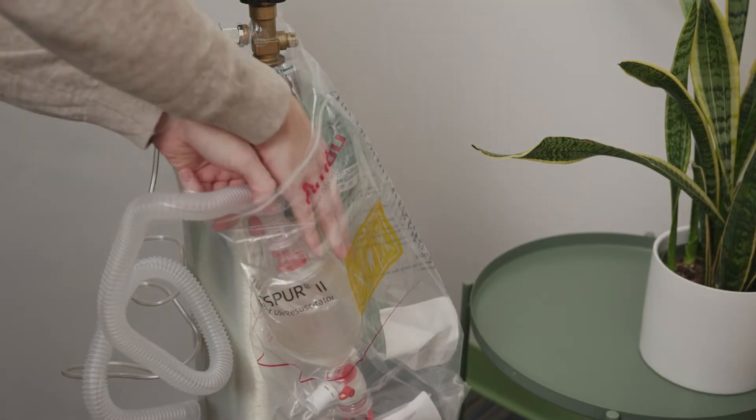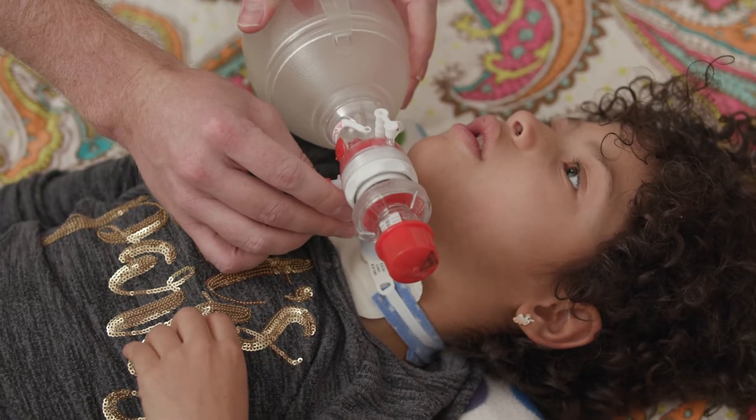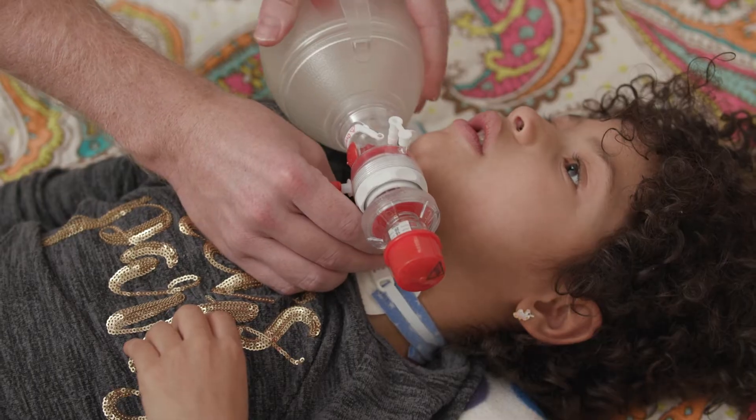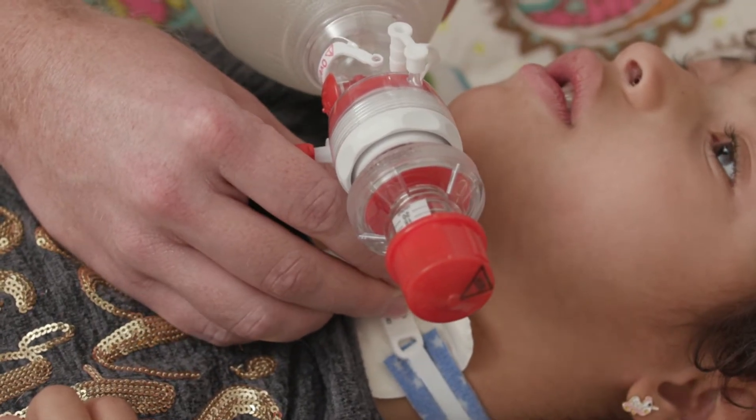If your child is on a ventilator, you will need to disconnect the ventilator and attach the resuscitation bag directly to the trach. If your child is not on a ventilator, you may skip this step and attach the bag directly to the trach hub.